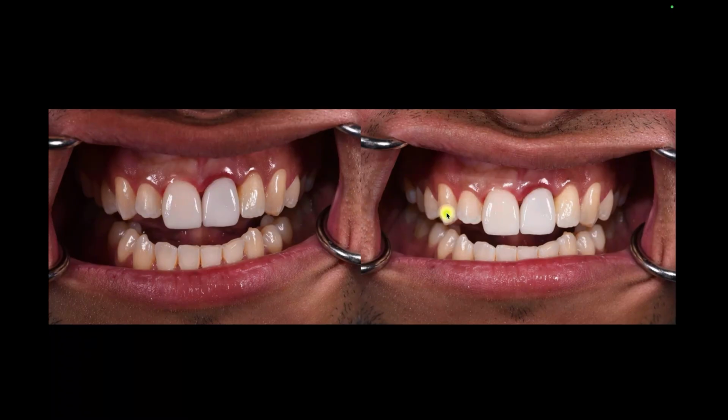Now, you're probably thinking, well, Peter, we're in a 2M world. I don't need it to be this white. You don't. Problem is I need something that's going to mask, and the only way to get that is with a brighter color in a really small area. So I'm probably going to wind up going with a more opacified ingot, because if I go here, I'm going to lose it, right? I'm going to not have what I need to do.